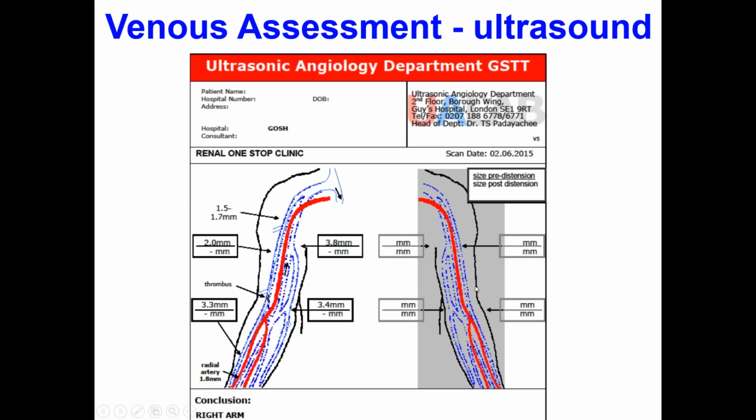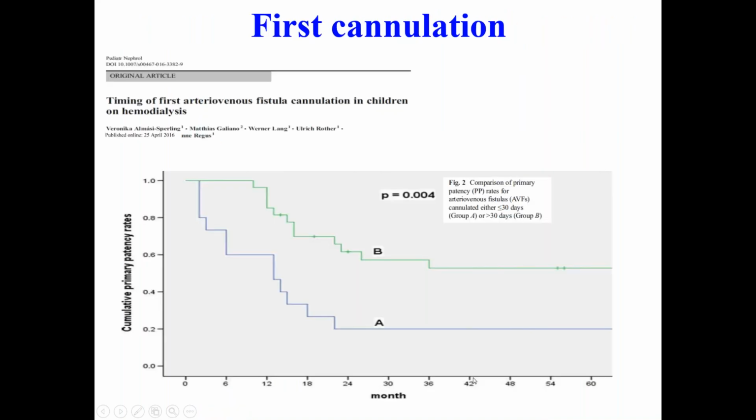Here, our ultrasound department will image both arms, really from the clavicle all the way down to the wrists, and there'll be two measurements at each level. It is with and without a tourniquet. At each level, you have two measurements, and a full comprehensive assessment of the veins on both arms is performed.